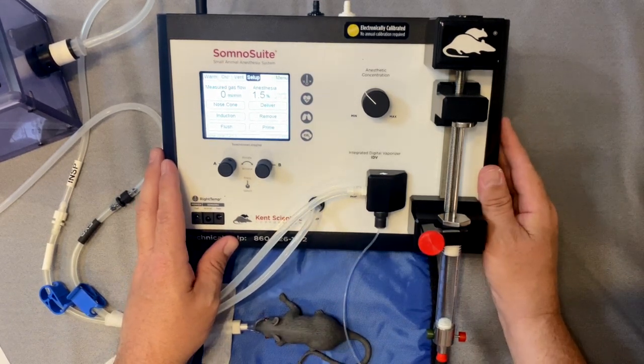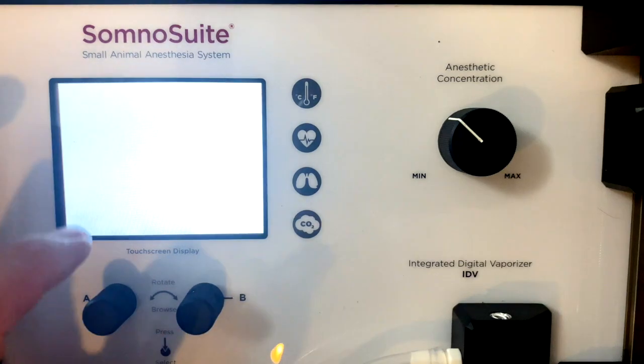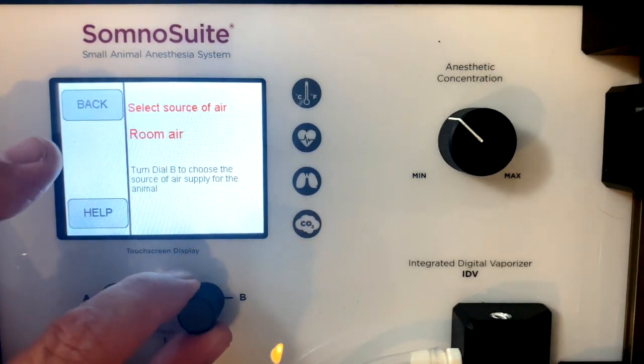To use room air as your carrier gas, simply go into the menu, select air source, and choose room air.